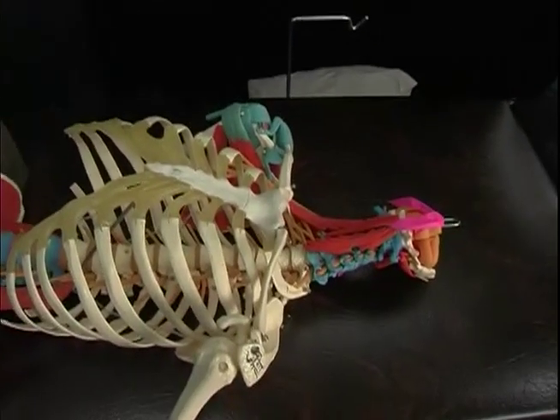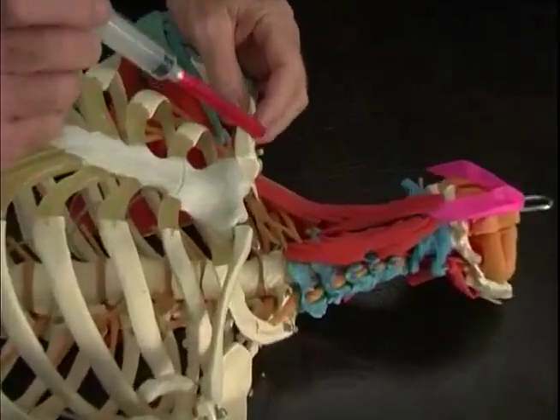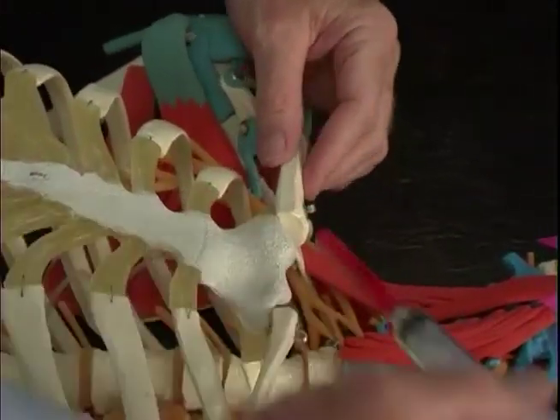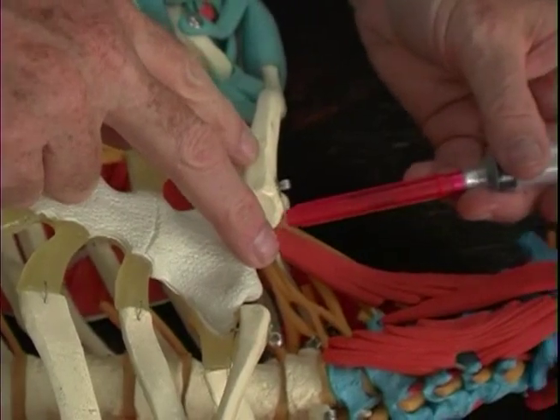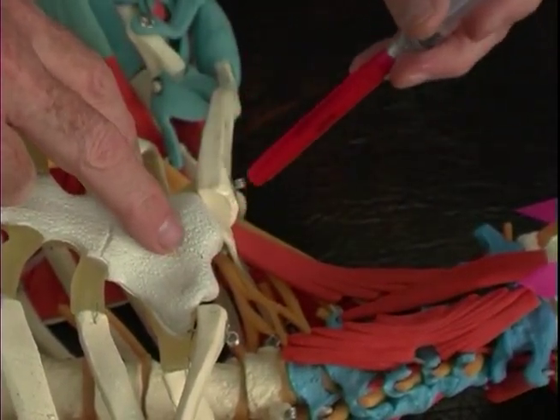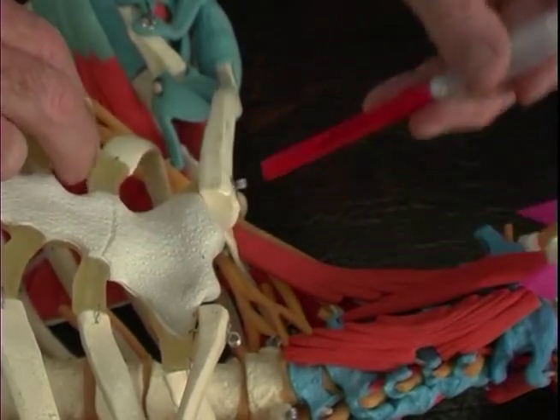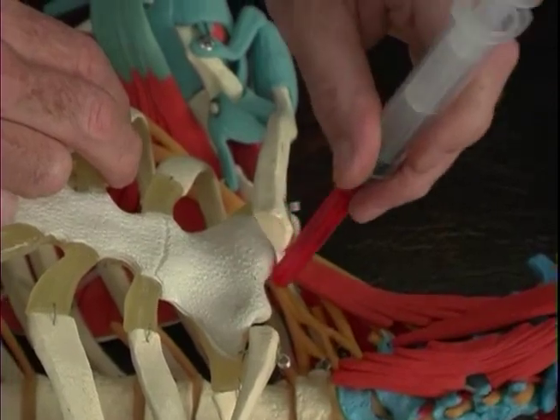In the front of the model, we're using the sternoclavicular joint, and we can see that it's kind of an angled joint, so to get in the joint we have to come in from this angle, but I don't think that's necessary. Most people who have pain in this have a large joint that's probably so inflamed that they don't have easy access to it. So I think that by injecting all around it, we do a fine job.